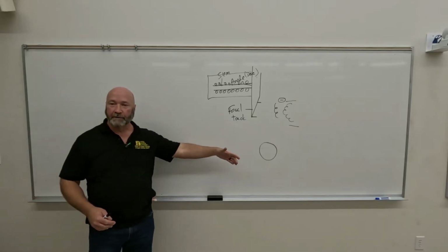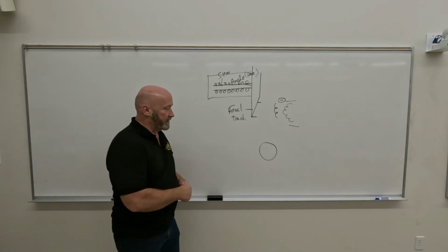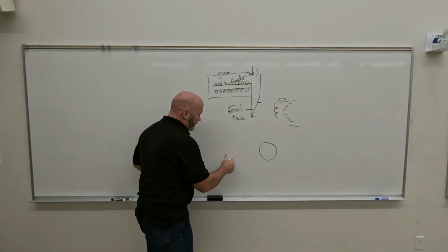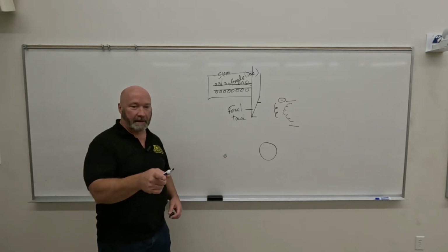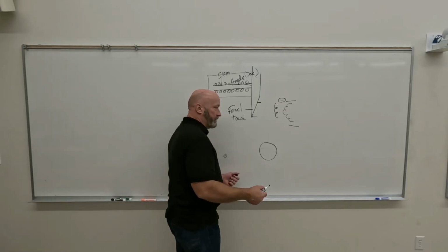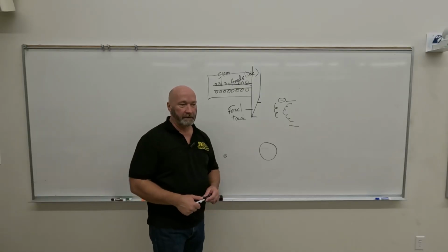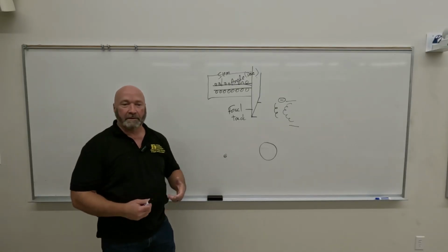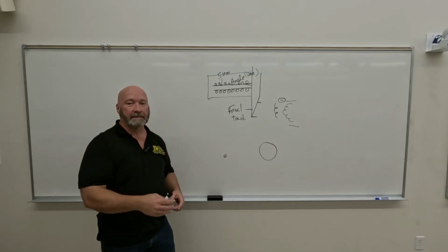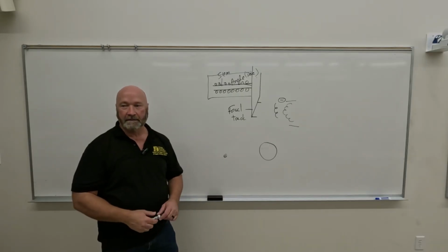So the closer to the nucleus we get, what happens? The electrons come screaming across the X-ray tube, approaching the speed of light. What's that? They change direction. So you're driving down the road, and you whip the wheel. It's a sharp turn. What's going to happen to your velocity, your speed, the energy of your car? It's going to slow down.